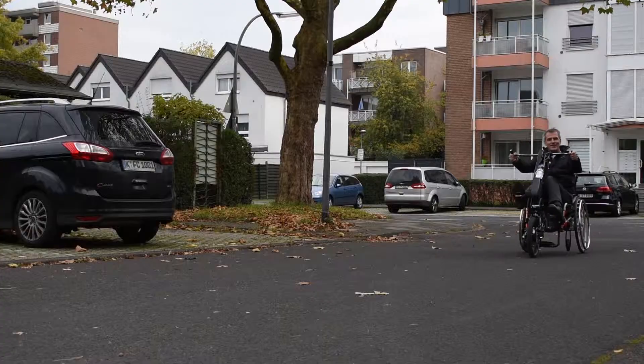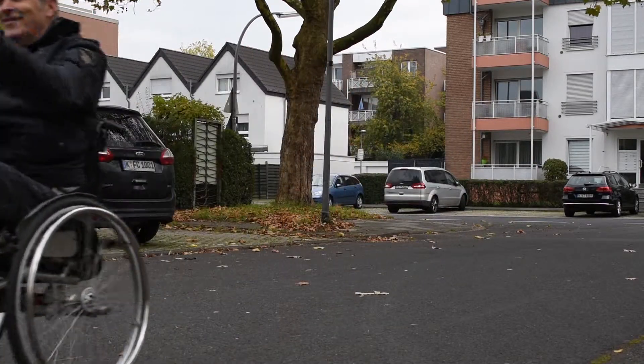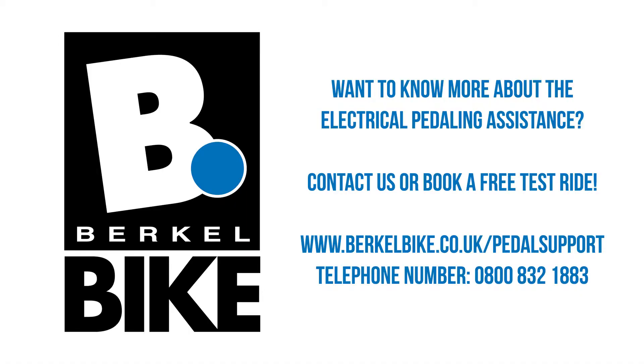There is also an extra large battery available to be able to cover even longer distances. Want to know more? Contact us or book a free test ride right away.